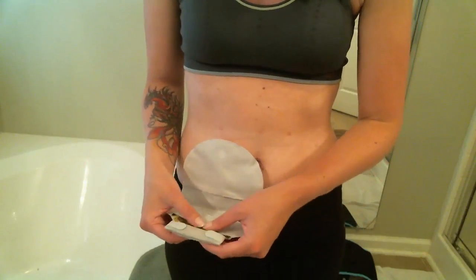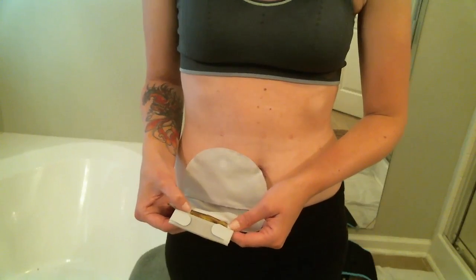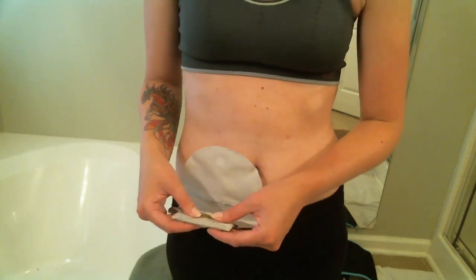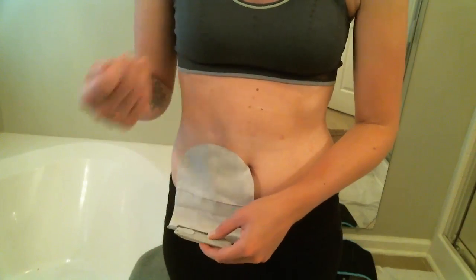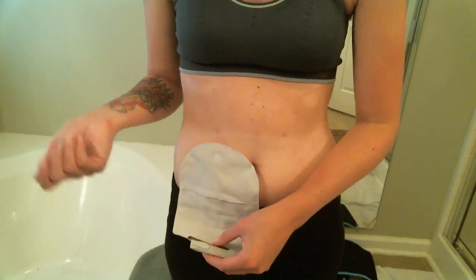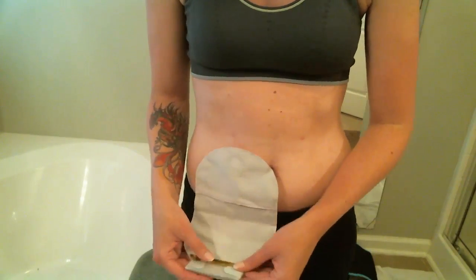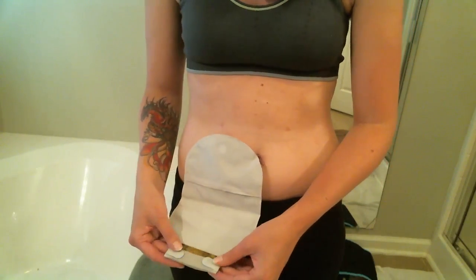So I was just sort of keeping an eye on it, and I could see a little bit through the bag down here, and I realized that it was actually bacon from a BLT sandwich that I had had earlier in the day. And I'd never had an issue with bacon before, but it just made me realize that if I'm eating more than a piece or two like I normally do, so having something more on something like a BLT sandwich, that I have to be a little careful of eating it and making sure that it gets extra chewed. So it is good to be able to keep an eye on things and know exactly what is coming out and what's going on in there.